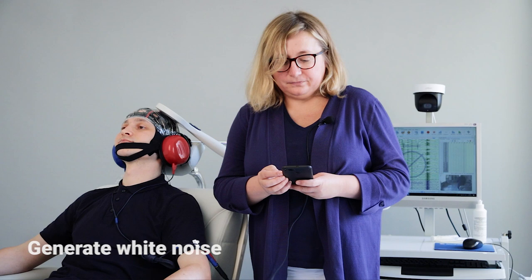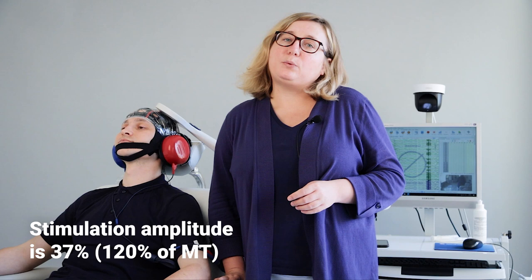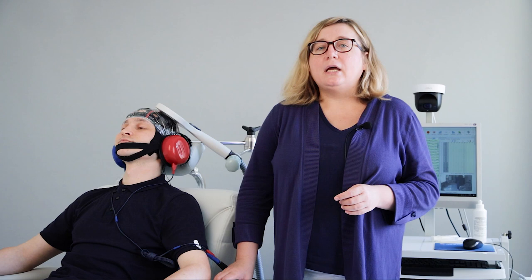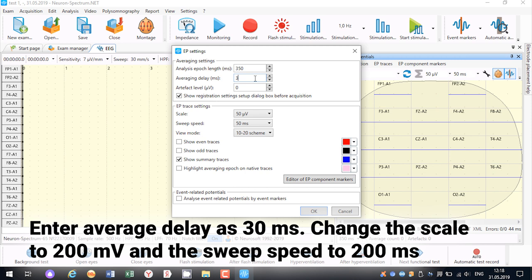Now we are ready for combining TMS-EEG. I generate white noise using the cell phone. Please pay attention — I will stimulate at an amplitude of 120% of motor threshold, and the amplitude of stimulation will be 37%. Go to Evoked Potential settings and enter the value of average delay as 30 ms.